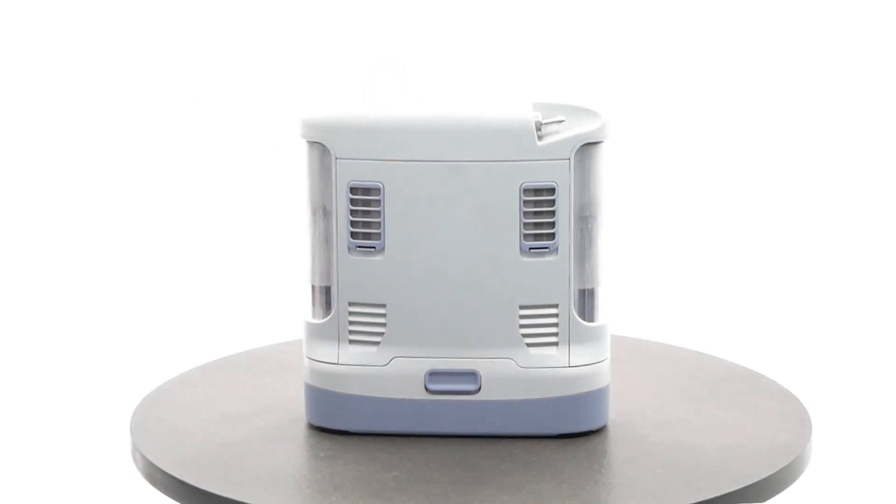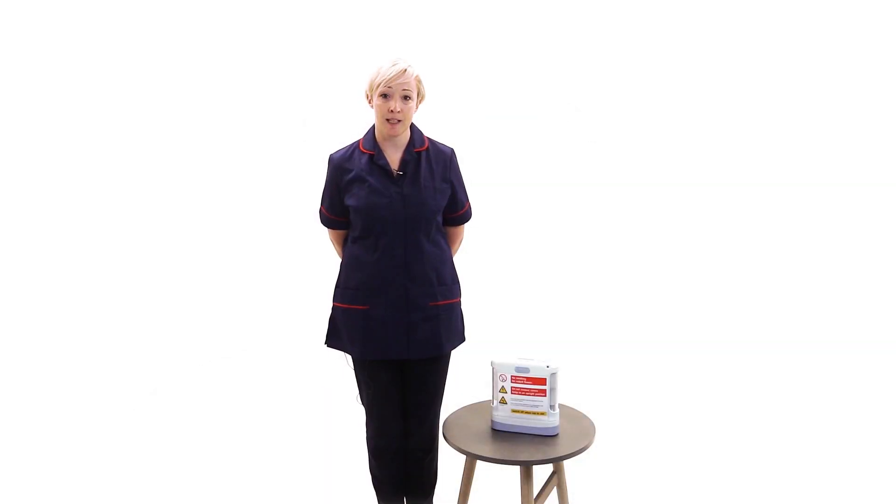A portable concentrator is small and lightweight and will enable you to get out and about as much as possible. The representative from your home oxygen service provider will have set up the concentrator as per your home oxygen prescription and will leave it ready for you to use. It is important that you do not alter the flow rate settings unless you have been instructed to do so by your healthcare professional.